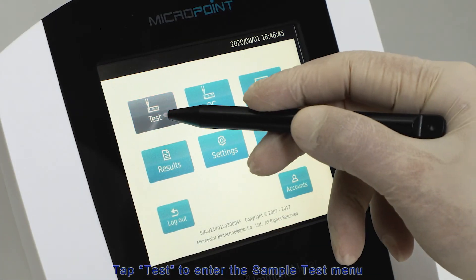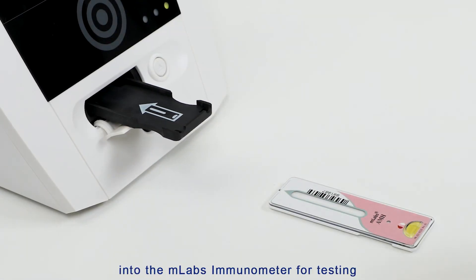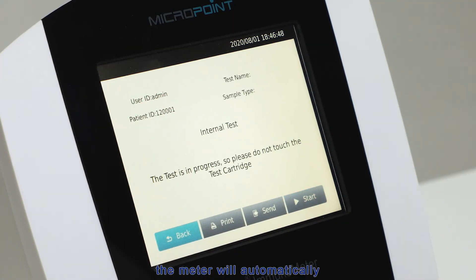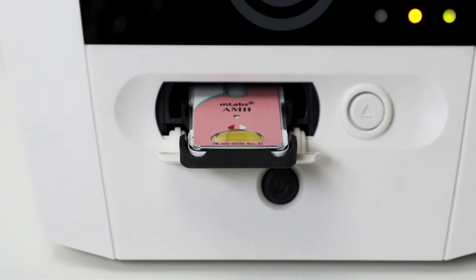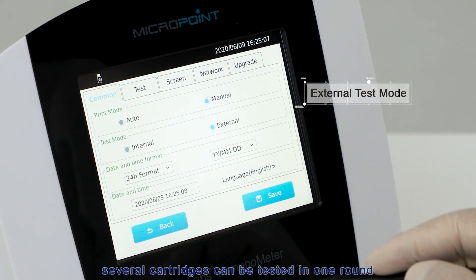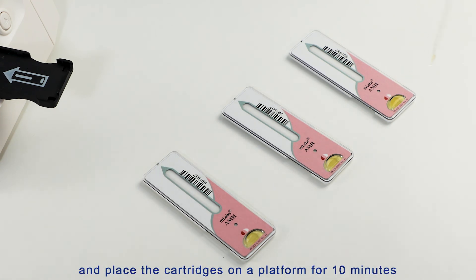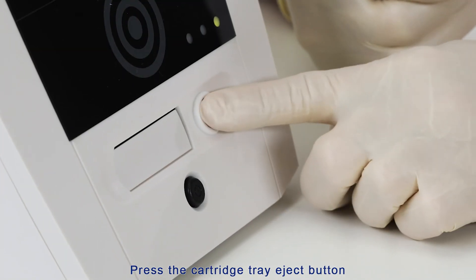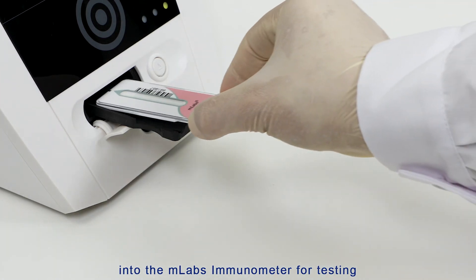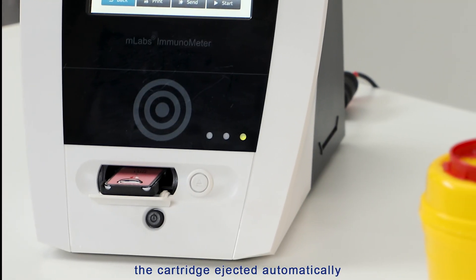Tap Test to enter the sample test menu. Press the cartridge tray eject button, then place the cartridge into the M-Labs Immunometer for testing. Press Start — the meter will automatically finish the test in a few minutes. For external mode, several cartridges can be tested in one round: add sample into the sample well and place the cartridges on the platform for 10 minutes. Then press the cartridge tray eject button and place the cartridges one by one into the M-Labs Immunometer for testing.